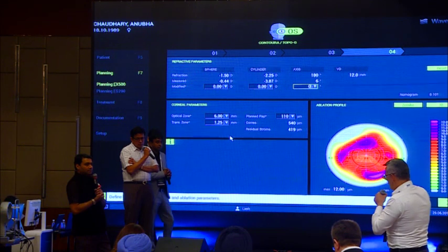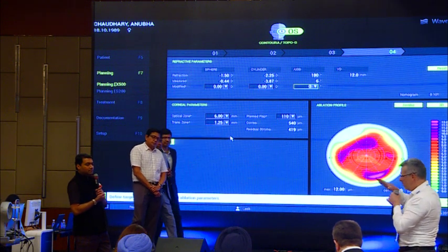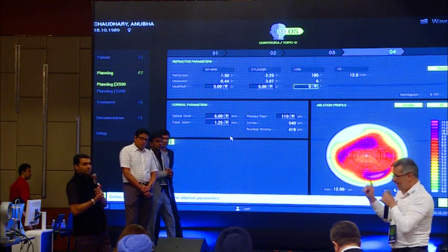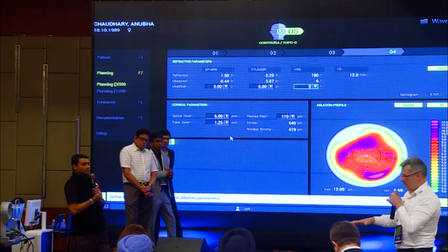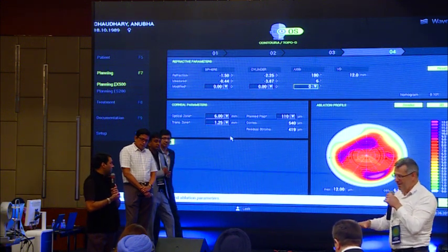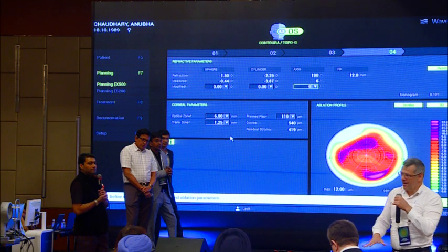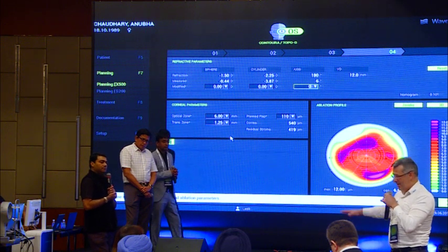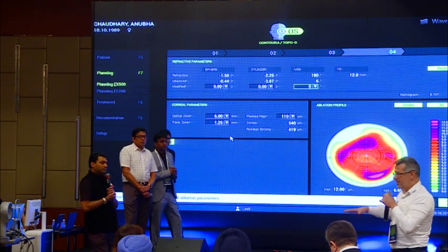Why? Because we have something that is called a correction matrix. This correction matrix calculates the amount of pulses to not lose energy from center to the periphery, plus biomechanical changes plus epithelial remodeling. So what I'm telling you is, if you do topography guided, even though you have no higher order aberrations, the ablation profile and the correction matrix is exactly adjusted for this eye. Even with no higher order aberrations, you will have a better corneal surface afterwards, and you will have better epithelialization, and we are taking this into account.